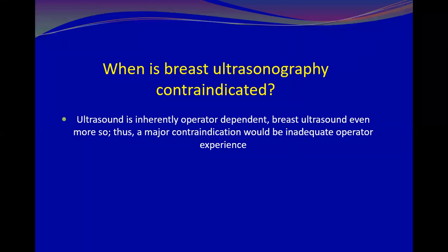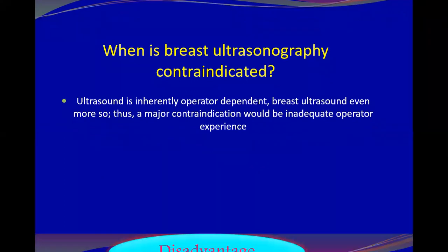You got it? Inadequate operator experience. This is the only contraindication for breast ultrasound. Not related to the patient. It is related to the operator.